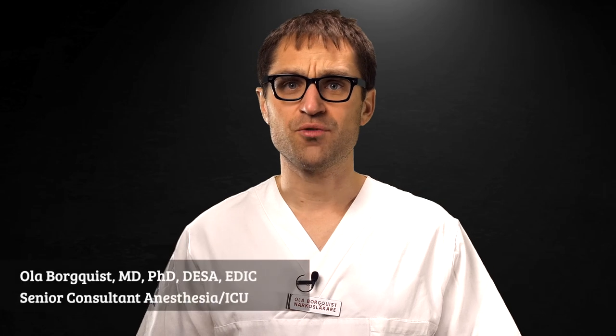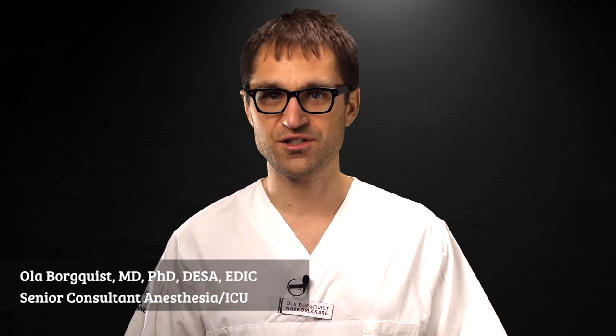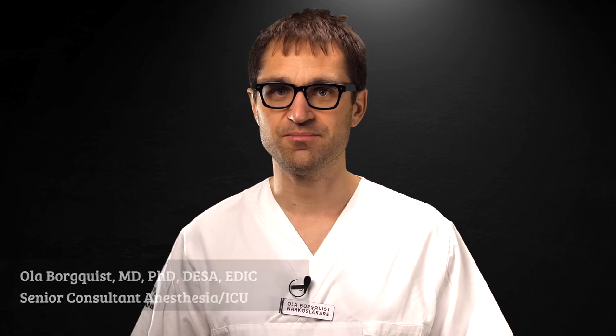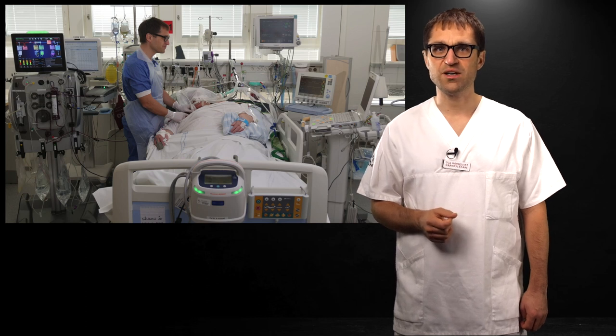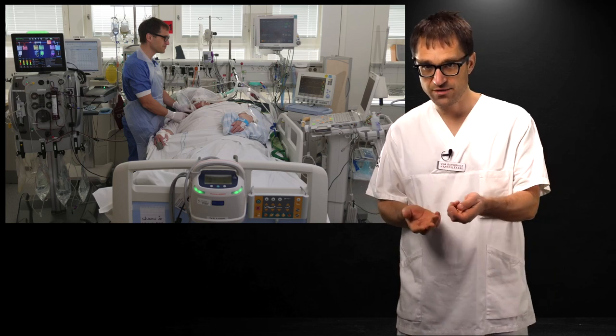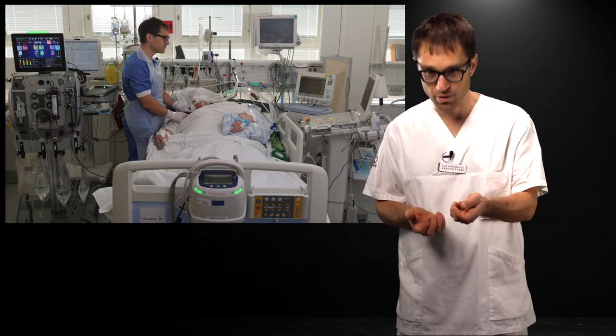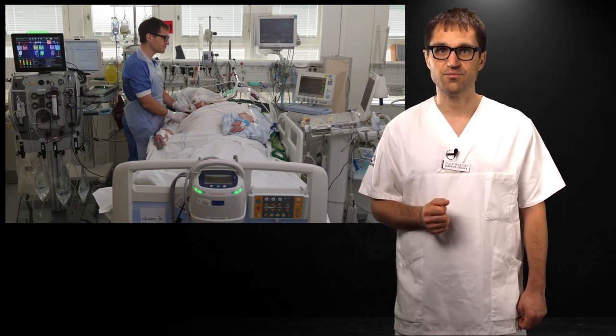In this lecture, we're going to walk you through the fundamentals of how the ultrasound machine works. Great images are a prerequisite for a safe and successful cannulation. Try not to compromise on your comfort, because that in turn compromises patient safety. Always place the ultrasound machine in front of you, so you can shift your gaze from your hands to the screen and back without getting disoriented, and raise the patient to a height that is comfortable for you.